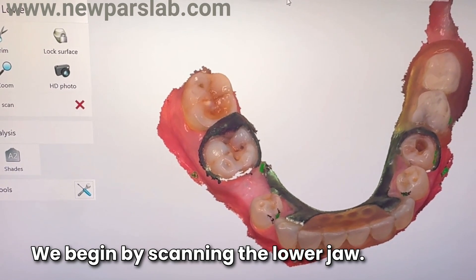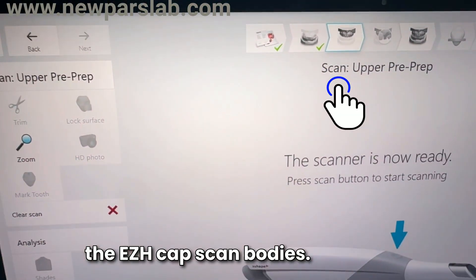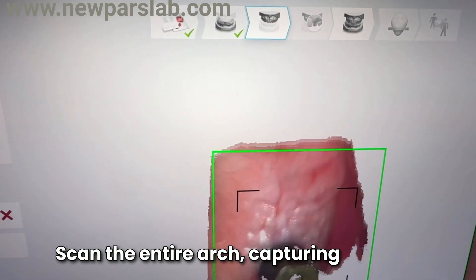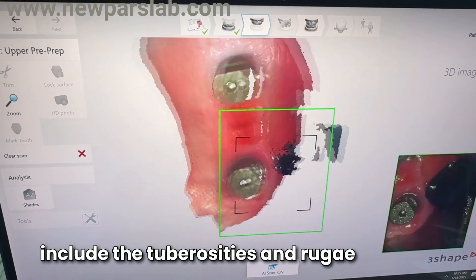We begin by scanning the lower jaw. After removing the temporary denture, we place the EZH cap scan bodies. Scan the entire arch, capturing as much detail as possible. For the upper jaw, be sure to include the tuberosities and rugae.